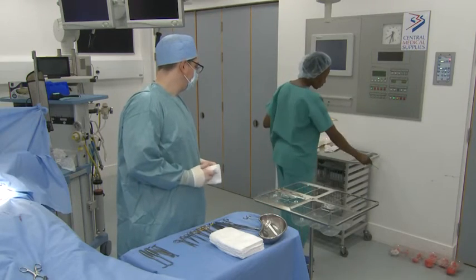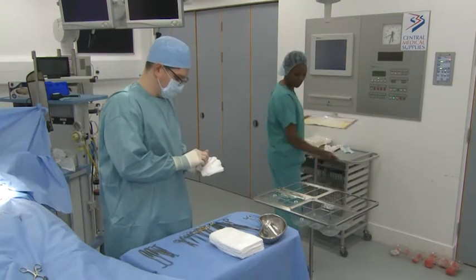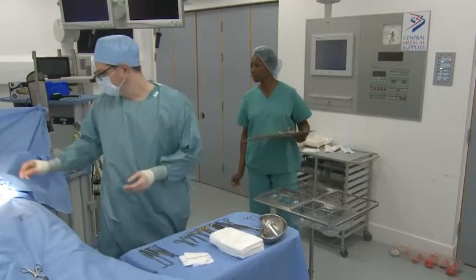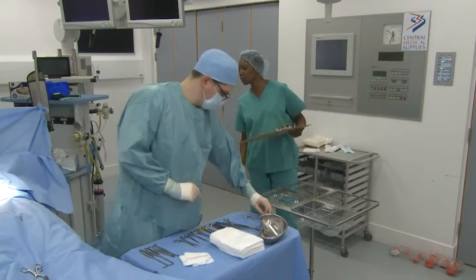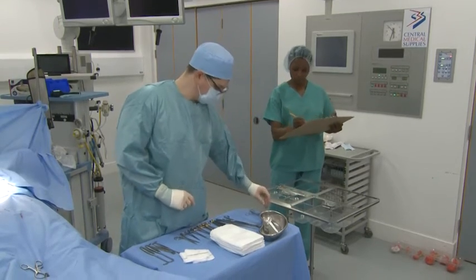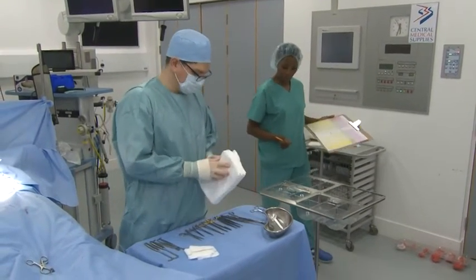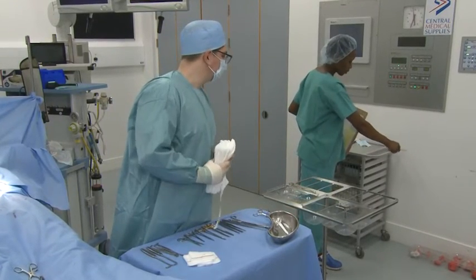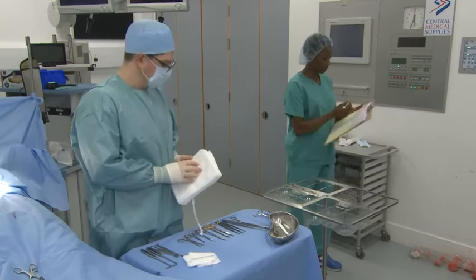The circulator then places the container in view of the scrub nurse. Often this can be against the wall by the whiteboard where the swabs are marked up. It is best to stack the swabs into piles according to what size swabs are in each container. The swab needle count board should be adjusted accordingly to advise the theatre scrub team that 5 swabs have been removed from the sterile field and red tie.